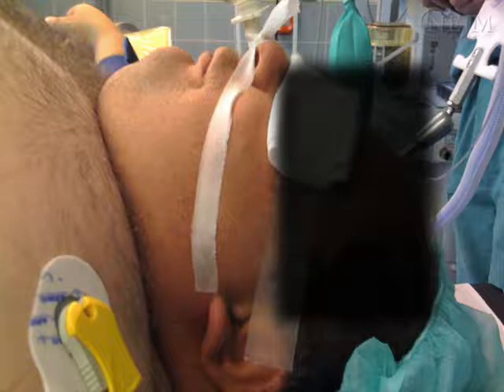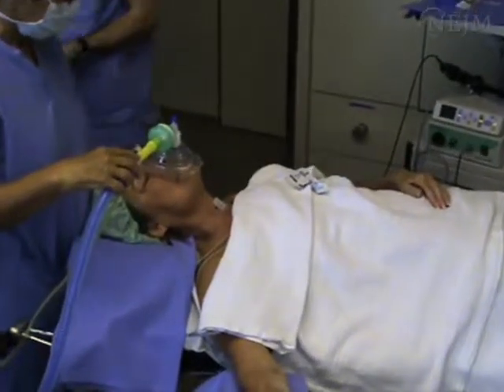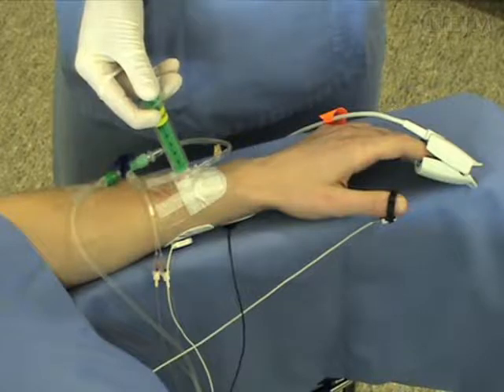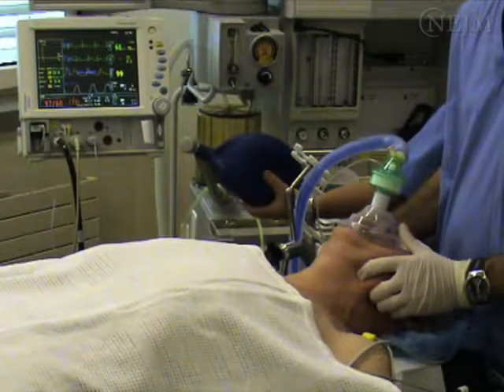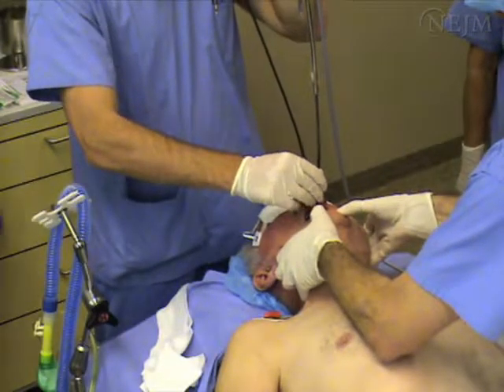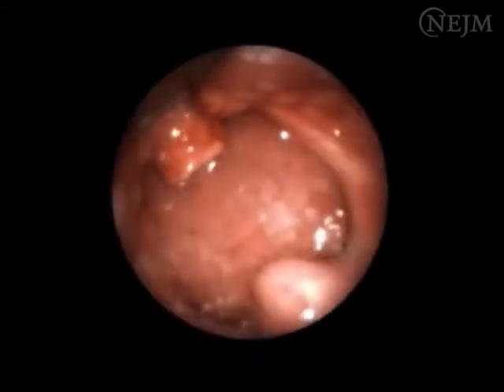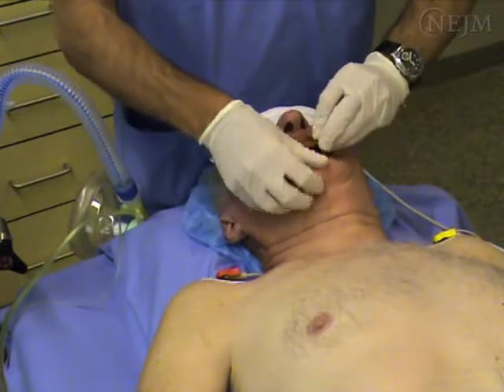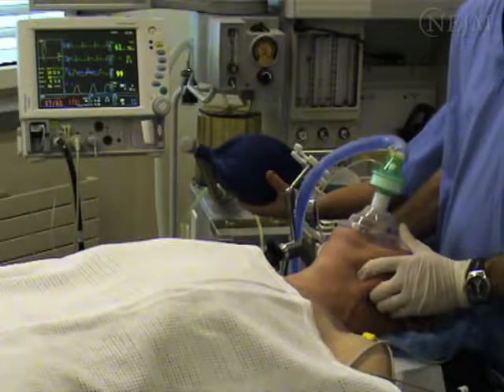Lack of patient cooperation precludes using an awake technique even in situations in which airway management is expected to be difficult. In such patients, general anesthesia should be induced only by experienced anesthesiologists. Oral fiberoptic intubation is indicated in the management of an unanticipated difficult laryngoscopy in the already anesthetized patient, provided that mask ventilation and therefore oxygenation are possible until fiberoptic intubation may be performed.